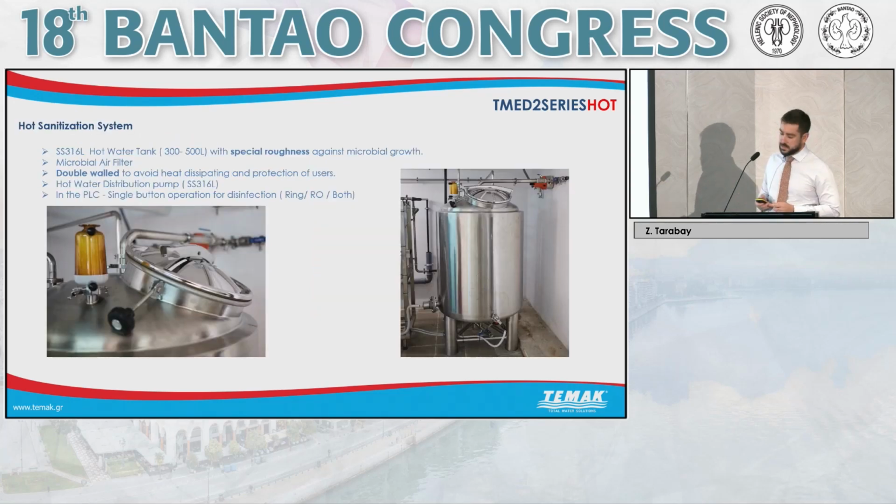The hot water sanitization system consists of a hot water tank. Usually the capacity is 300 to 500 liters. This is also with special roughness against microbial growth. You have the microbial air filter to filter out any microbes entering the tank. The tank itself is double-walled to avoid any heat dissipating and protection of the users.